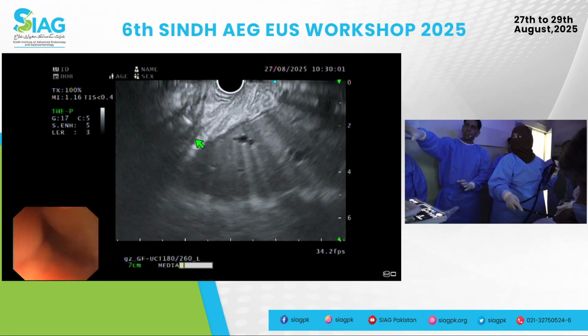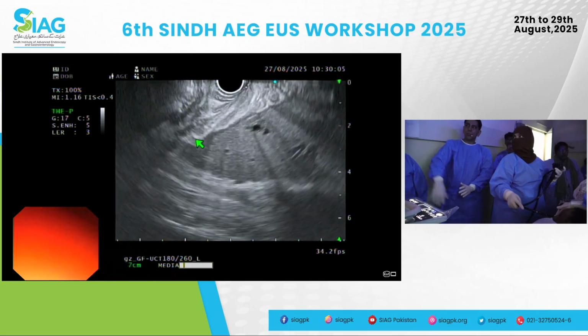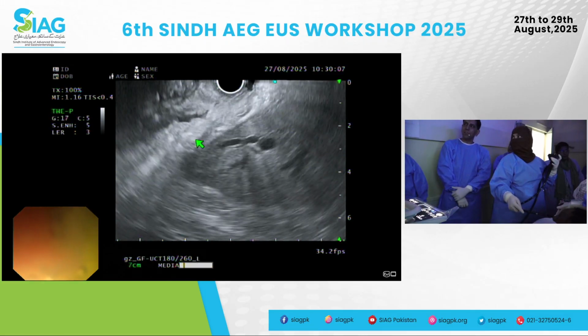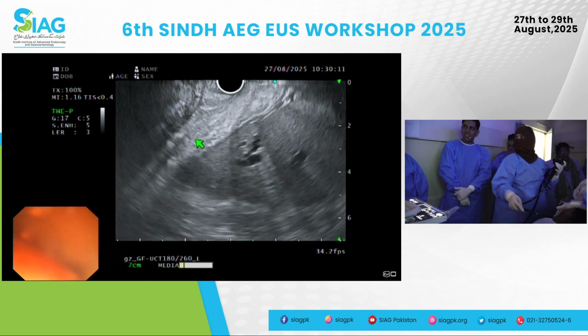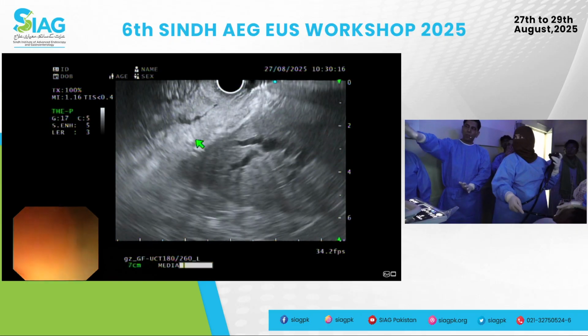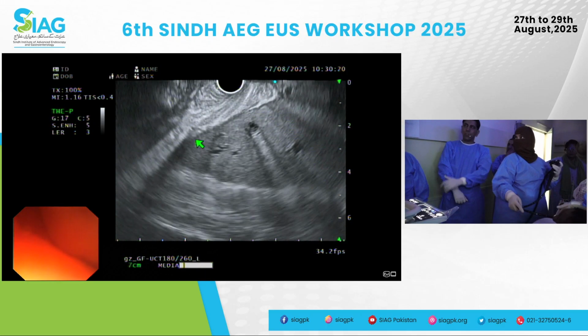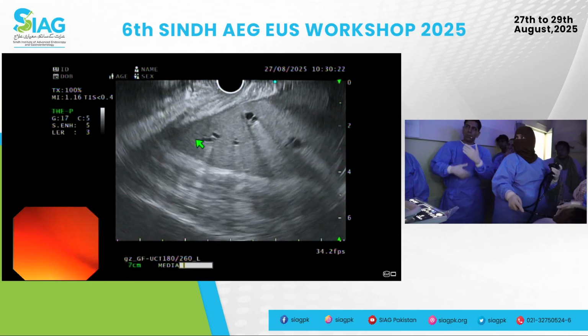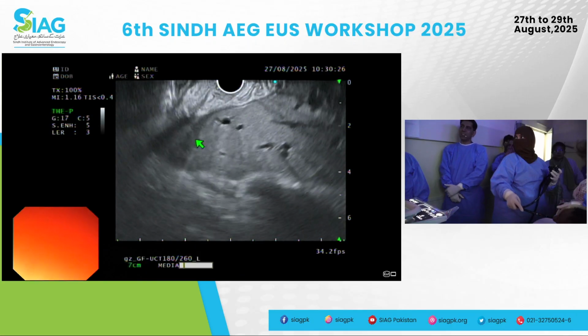Good. Okay. Now the second thing is, can you see any focal lesion in the liver? Not now. Good. So now just keep scanning the liver and see, what else do you see? Dilated duct. Fantastic, excellent. So the intrahepatic ducts remain dilated, no perihepatic ascites, no focal lesions so far. Yeah, good, excellent. So you're improving your coupling, you're ensuring there's no air. Good, excellent.